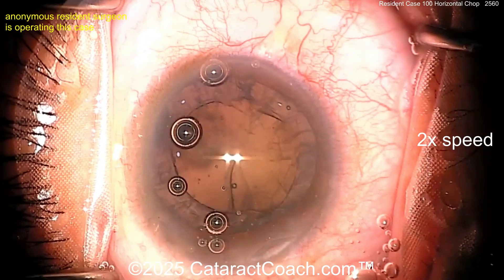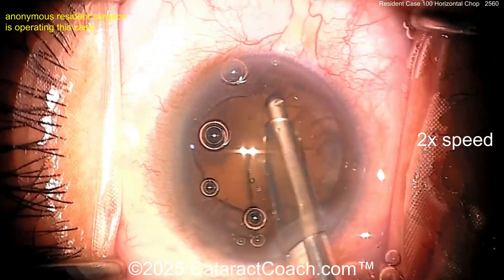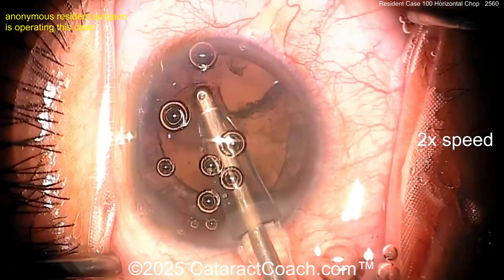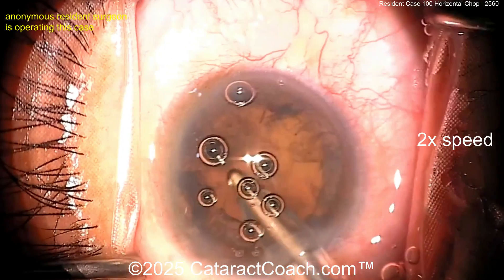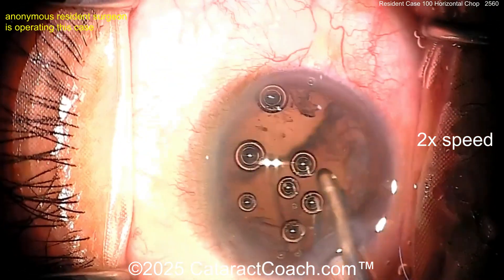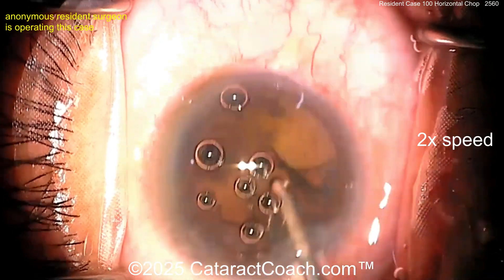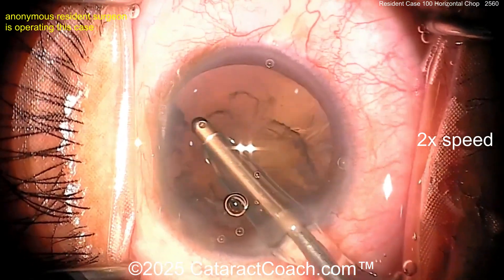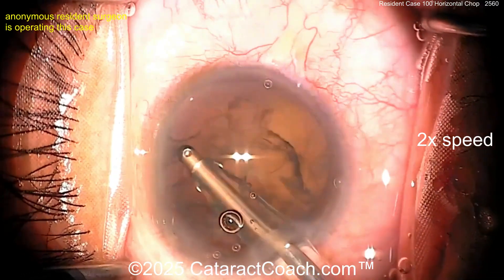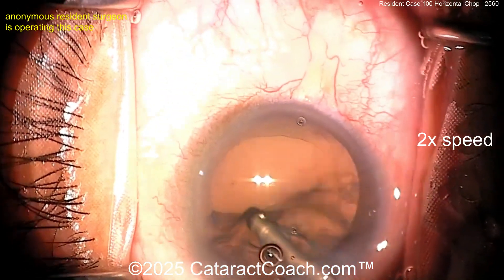It's a bimanual irrigating chopper going inside. Let's see the cortex removal — coaxial cortex removal. When you get this cortex, I like to grab it and move more circumferentially, getting a few clock hours at once. I don't like to strip off just one clock hour or ten to twenty degrees at a time. Getting the sub-incisional cortex first makes life a little bit easier.